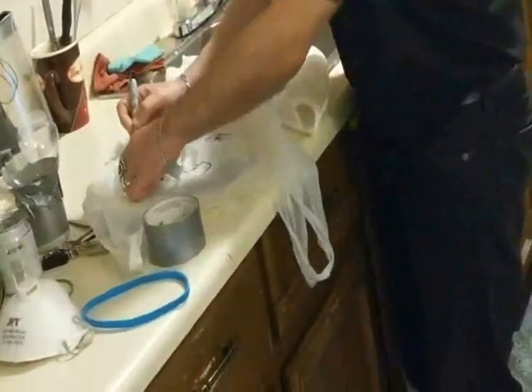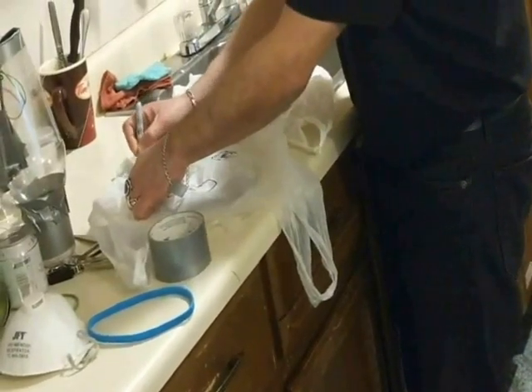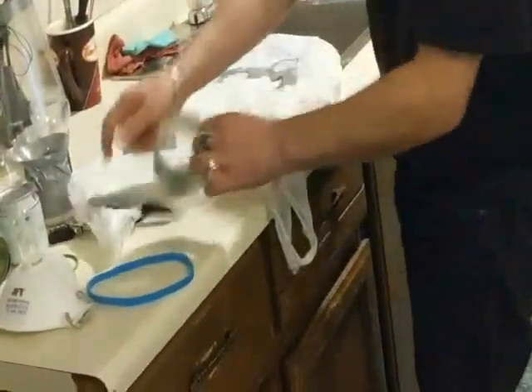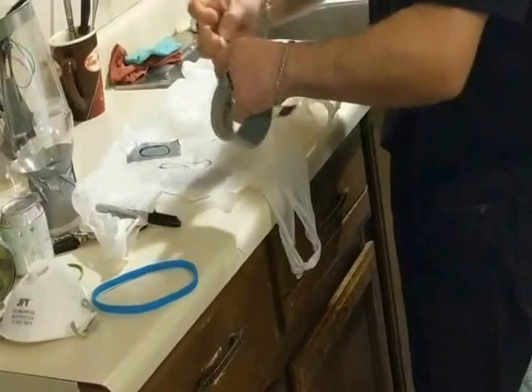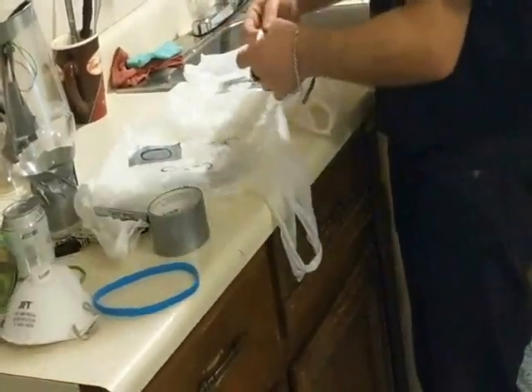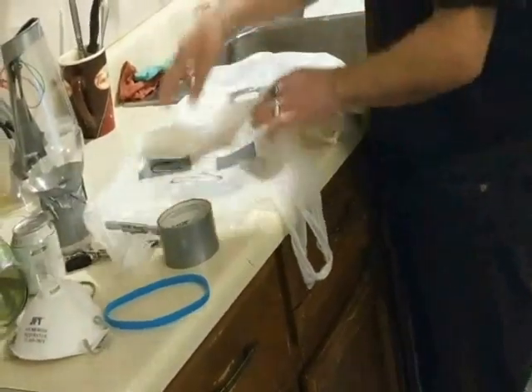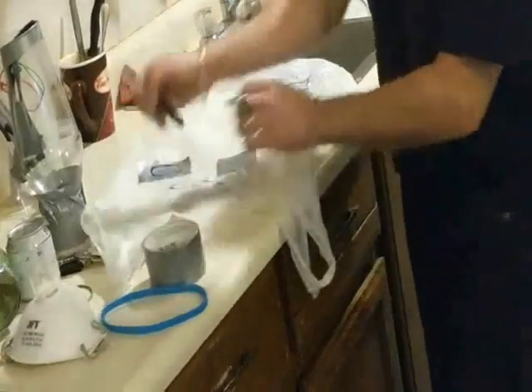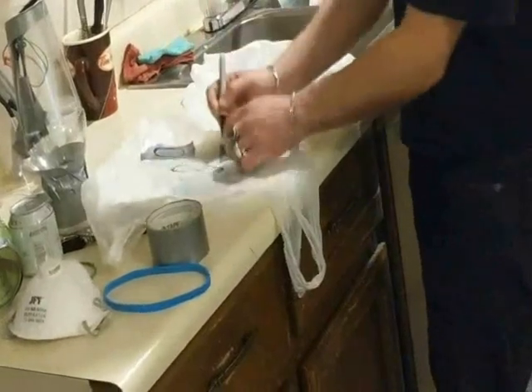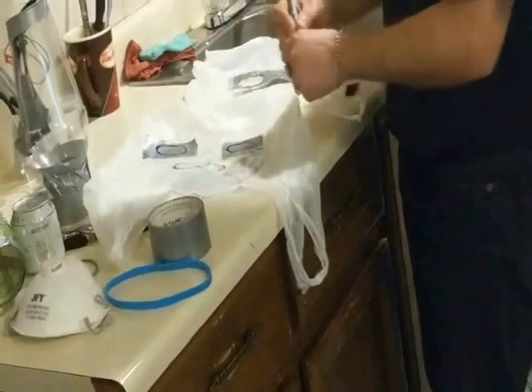Then you're going to be drawing a circle, pretty much where that circle is going to be, like that, where your eye is going to be. There's your eye, right? Then the second one, your second eye, the left eye, right eye. Now I haven't put this on my head because I'm just doing it for you guys to watch, and we're off a little bit over here, which is not right. But there you go.